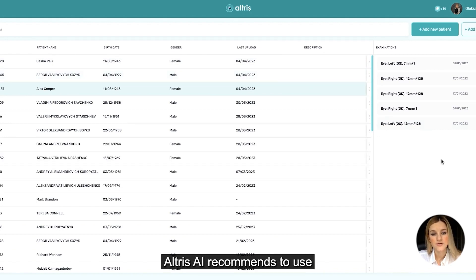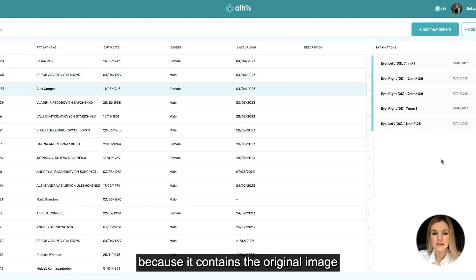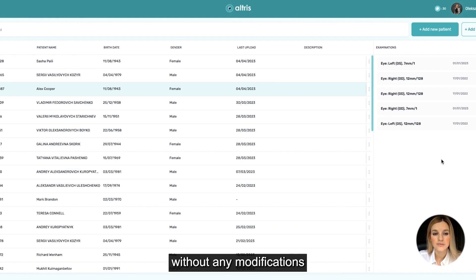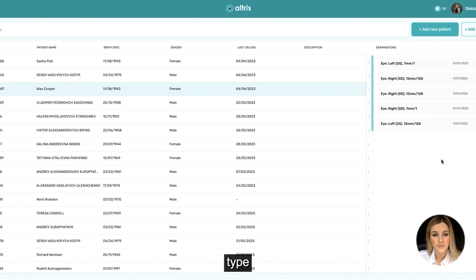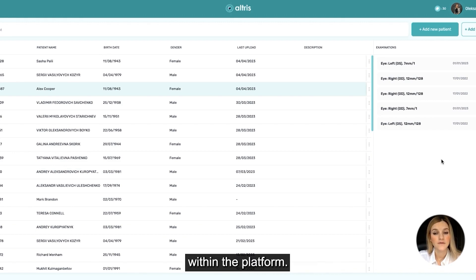Altric AI recommends using the DICOM file format because it contains the original image pixel data without any modifications, along with the study metadata. Therefore, using the DICOM type of file gives you more opportunities within the platform.